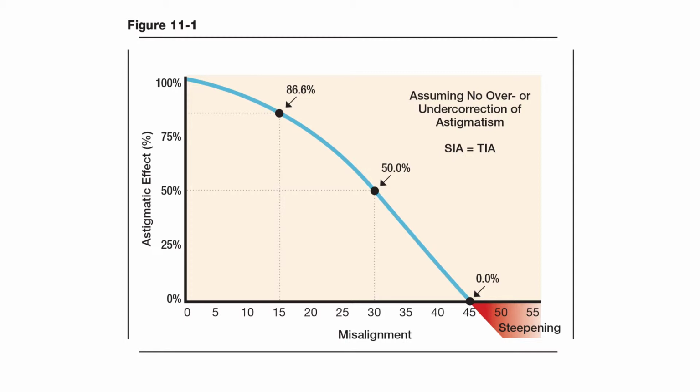The Assort toric IOL refractive surprise calculator tells me how much reduction in refractive cylinder can be gained by rotating the already implanted IOL. Dr. Daniel Tognetto from Trieste published a paper in the JCRS in 2018 that showed that when you're 30 degrees off, you haven't lost all the effect. You've only lost half the effect of the toricity. You don't lose all the effect until you're 45 degrees off. So misalignment is a lot more forgiving than most people are stating.